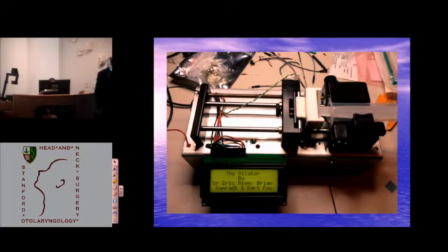And so you've got a balloon dilator and a stricture, and you hit the start button, and we have it working. The balloon dilates up until it first meets resistance, the minimal resistance. Now it's against the stricture. Now, the next phase is 1 millimeter. And then this equipment senses when that stricture gives way to that first step. And then it's repeated and repeated. And so this is all automated.